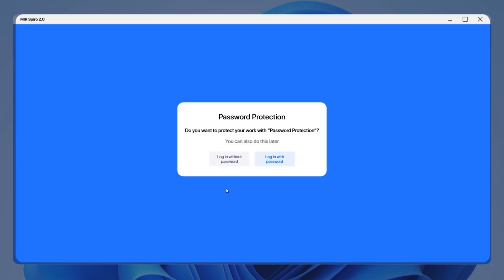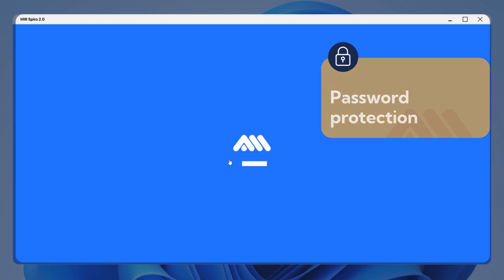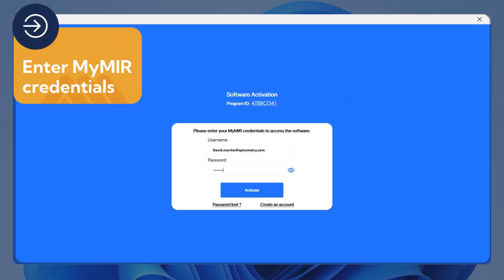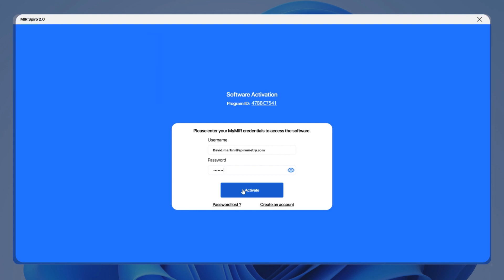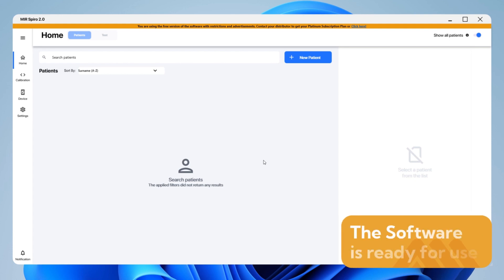MIR Spiro also offers the possibility to further protect your work with the option Password Protection. It is not a mandatory option and you can access it whenever you want. Now enter your MyMIR account credentials to activate MIR Spiro Software. The software is now active and ready for use.